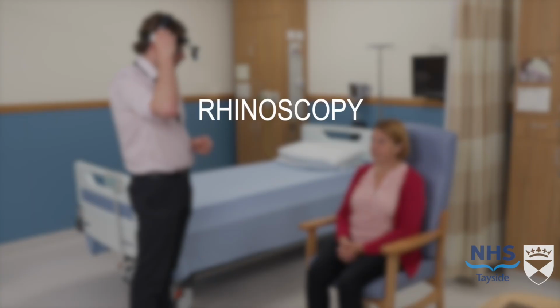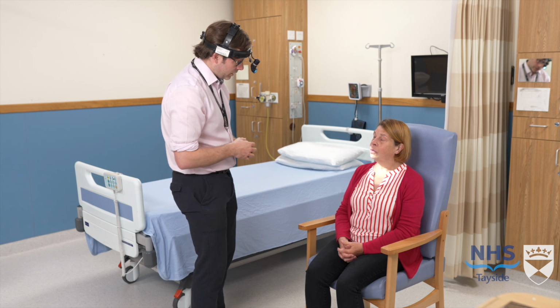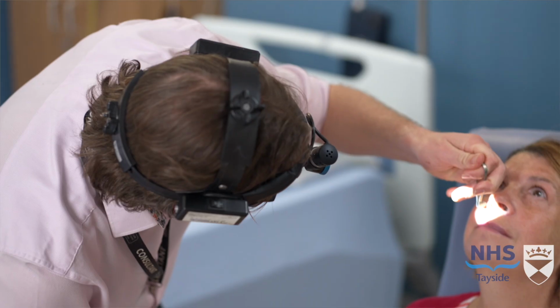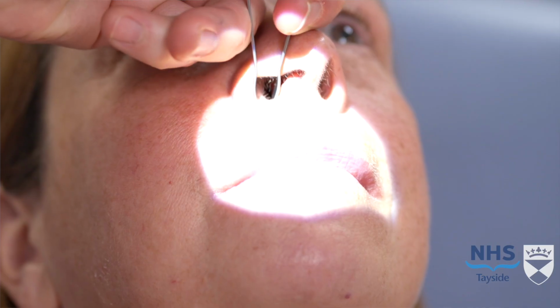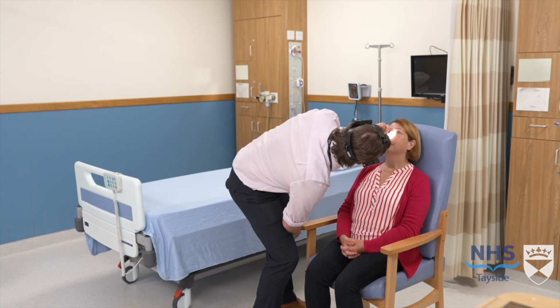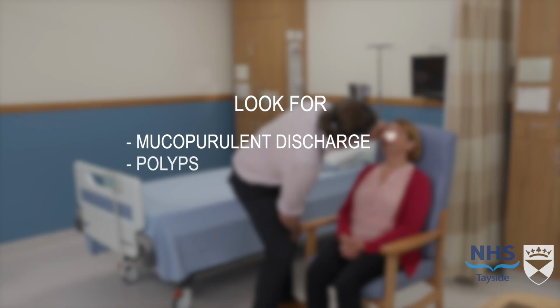This is a difficult skill to learn with the Thudichum speculum, and most people will therefore use an otoscope. You are assessing the first part of the nasal airway. In a normal examination, you should be able to comment on the nasal vestibule, septum, inferior turbinate, and any obvious pathology in the inferior or middle meatus, such as mucopurulent discharge or polyps.